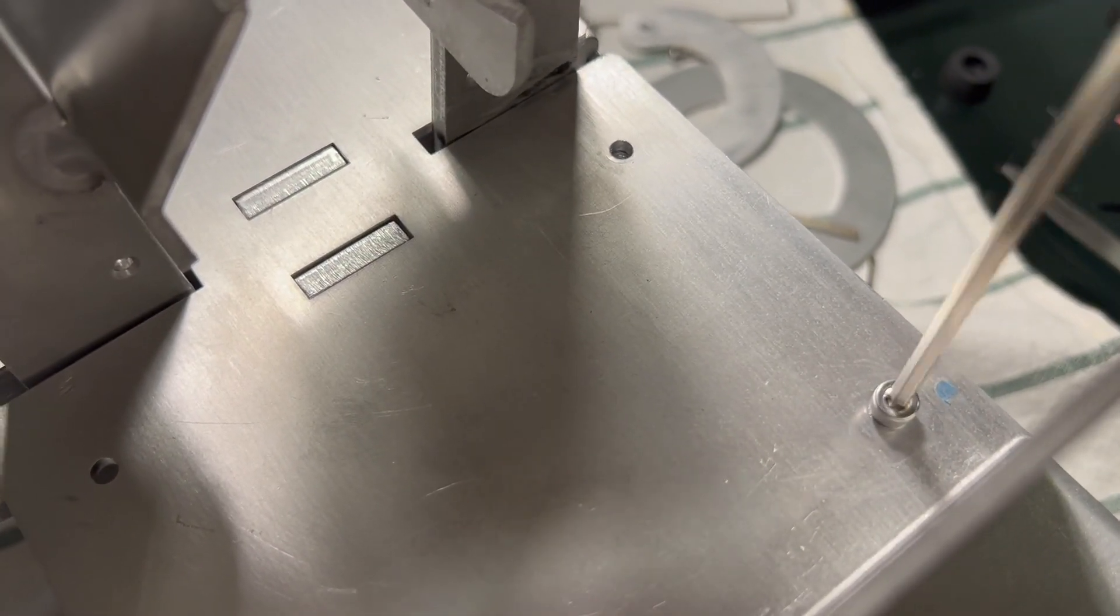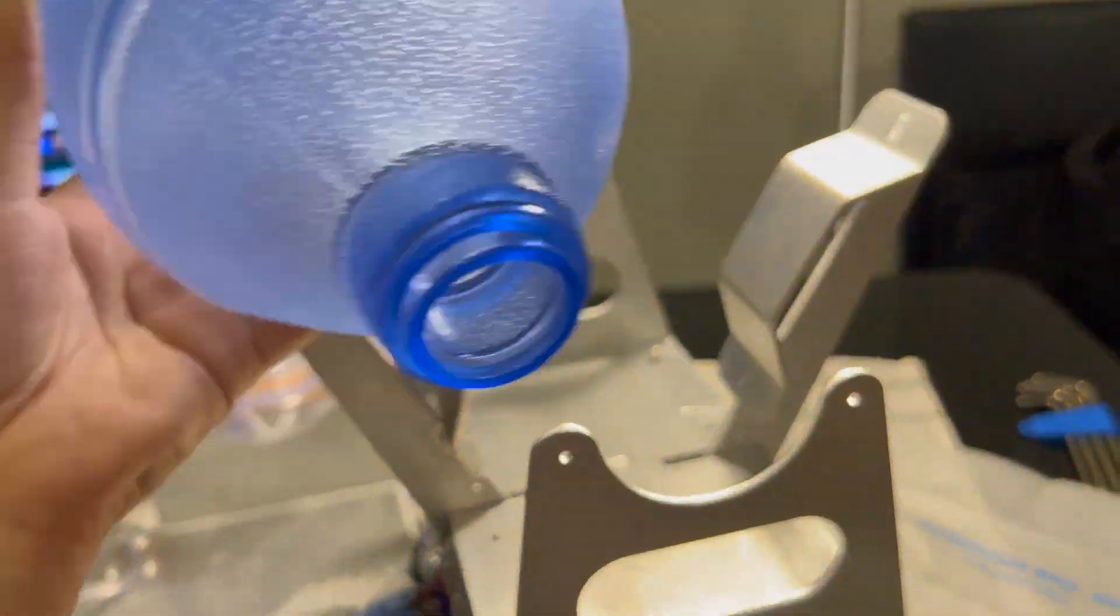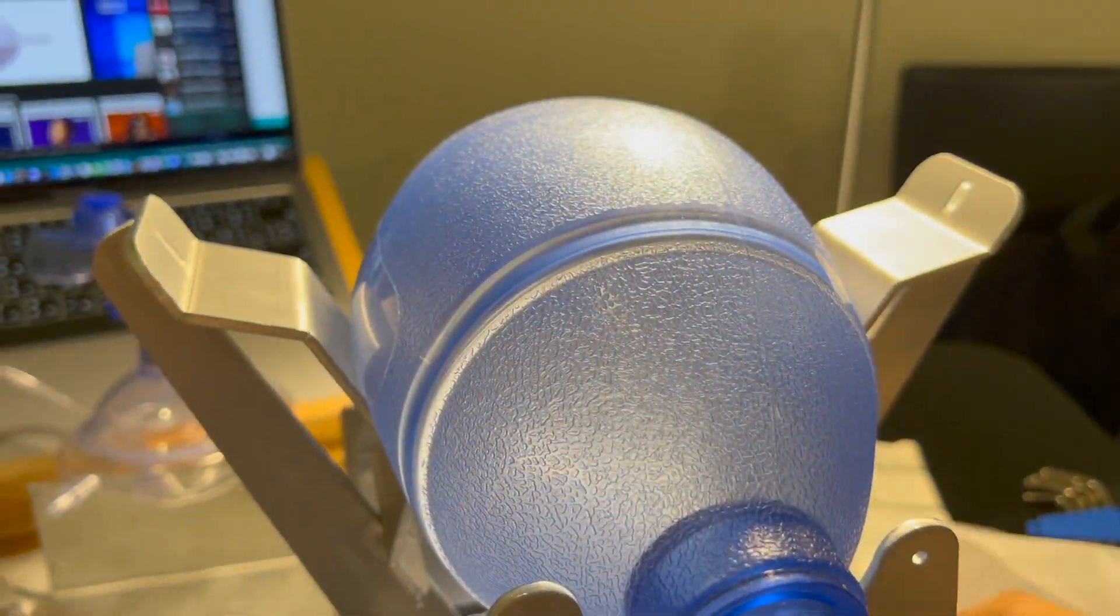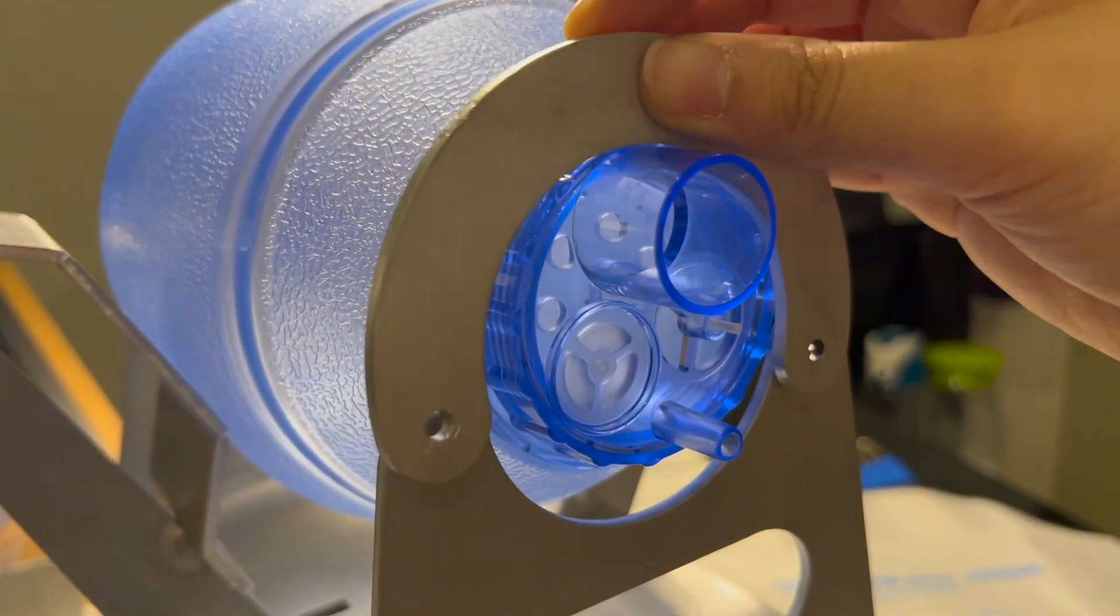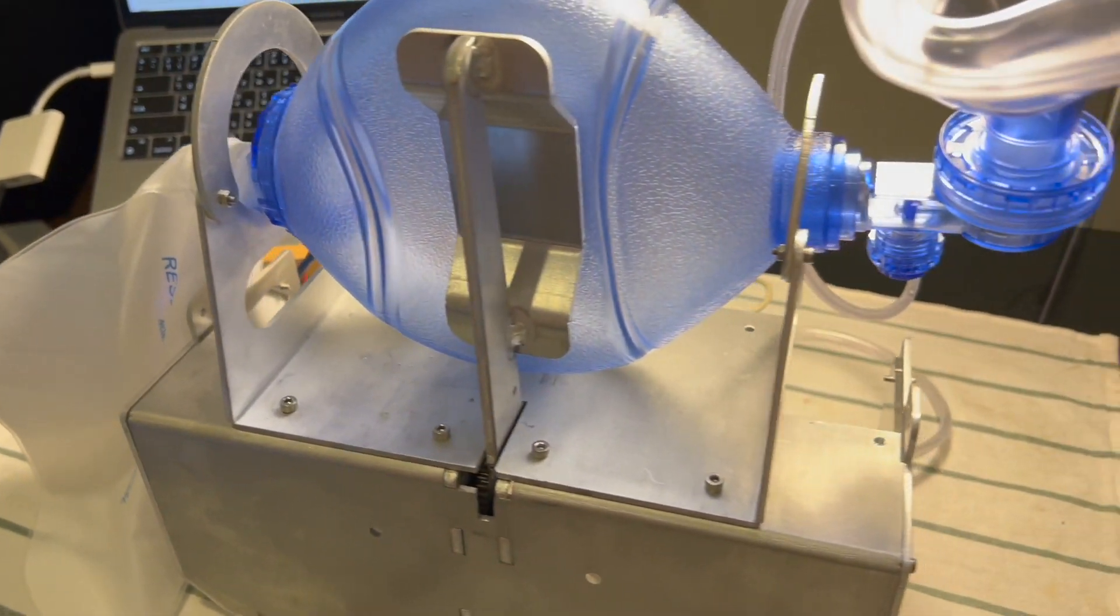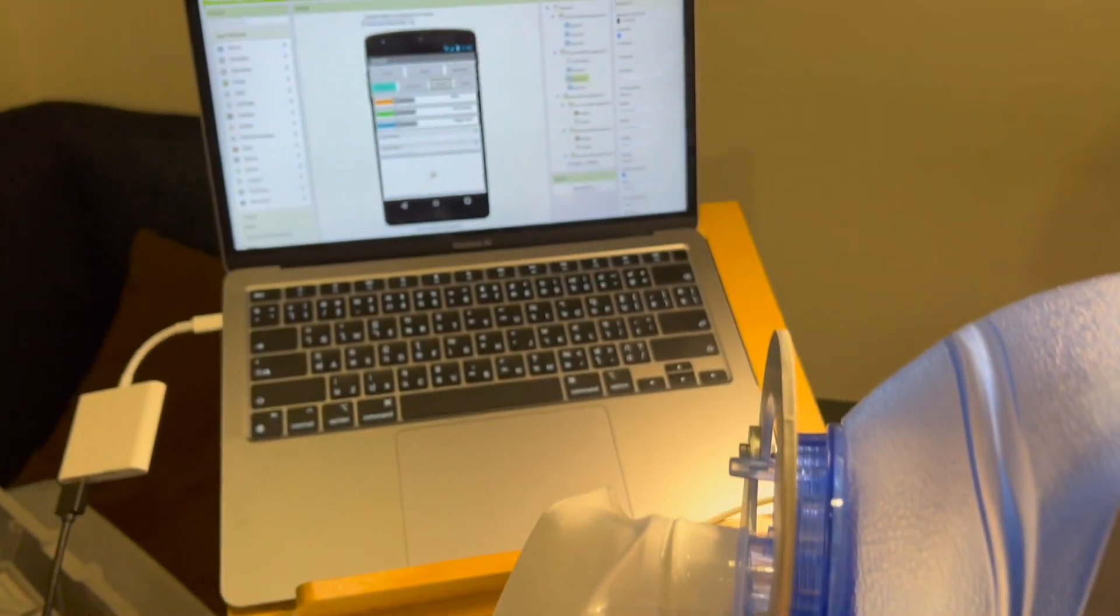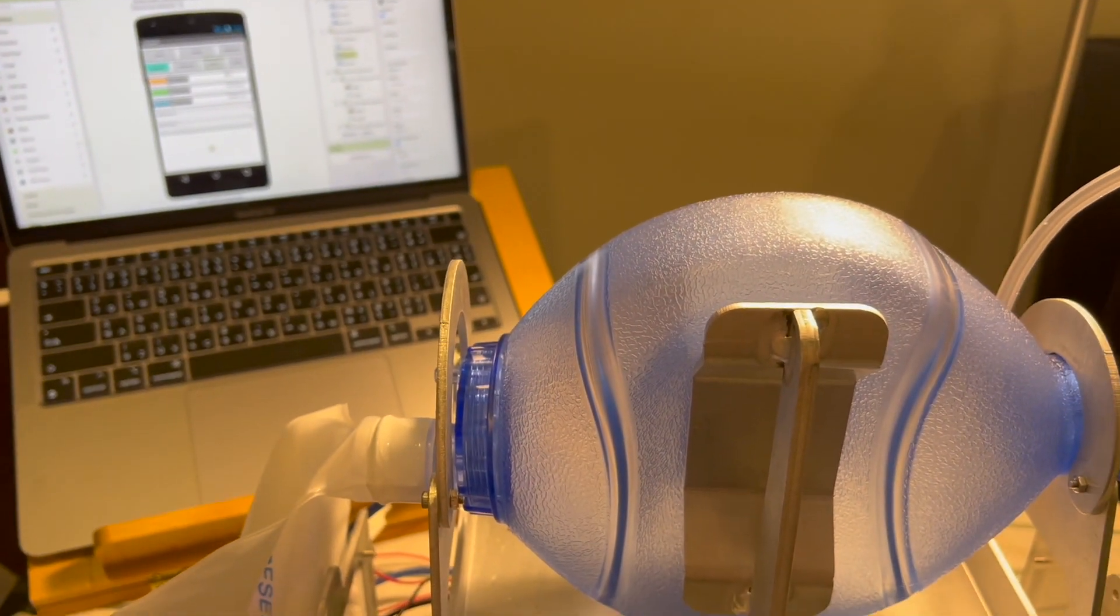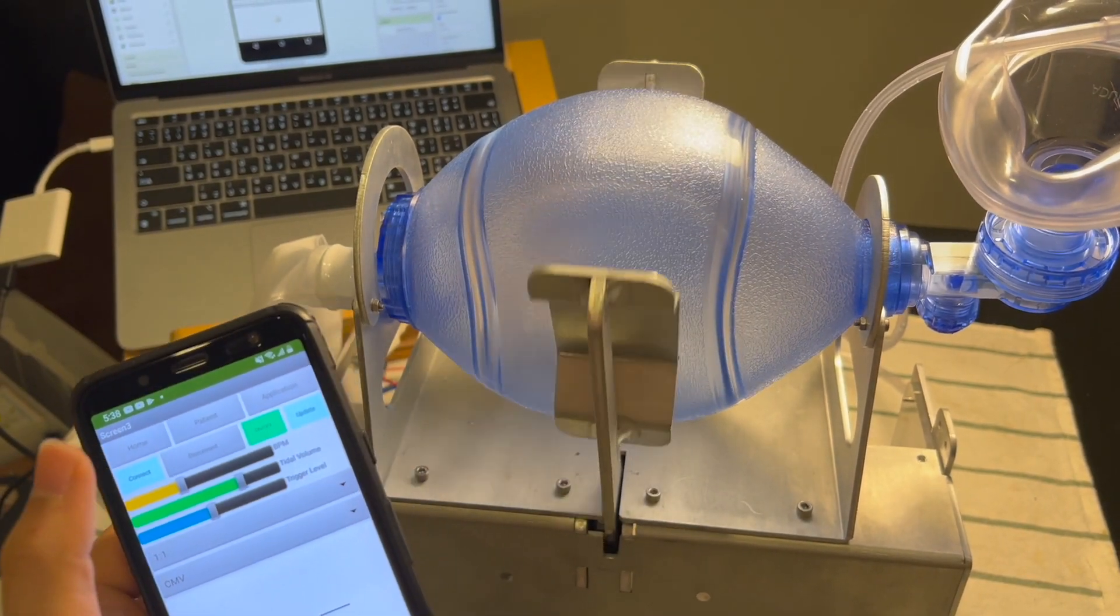Next is the ACV mode or the assist control ventilation. This mode is important for recovering patients who are starting to breathe on their own. In essence, the patient will breathe in naturally while the equipment monitors the breathing cycle. The ventilator will help when the patient is absent from the breathing cycle. And this is the CMV mode.